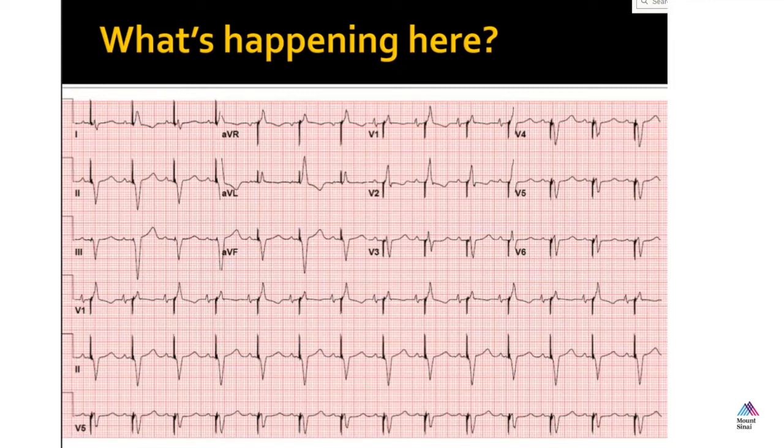So one thought is that if the patient is having his own QRS, and then the other one is the paced one. Right. So probably this patient has some of their own conduction.